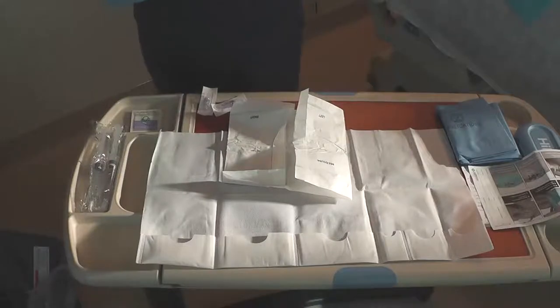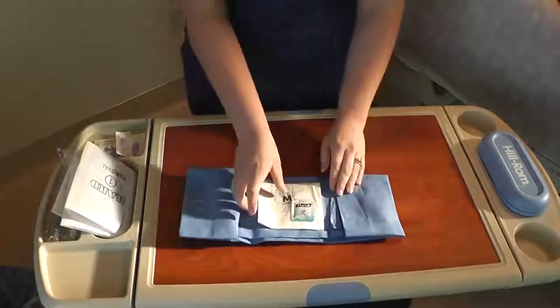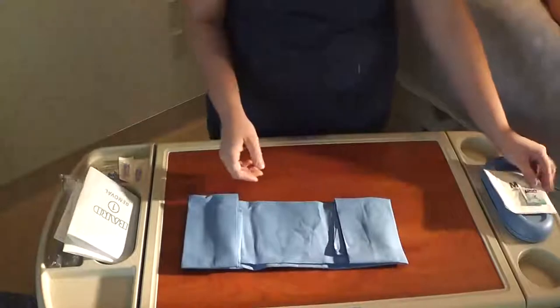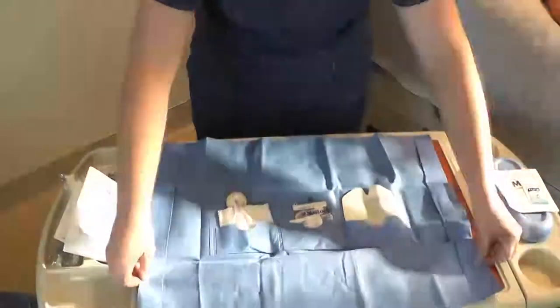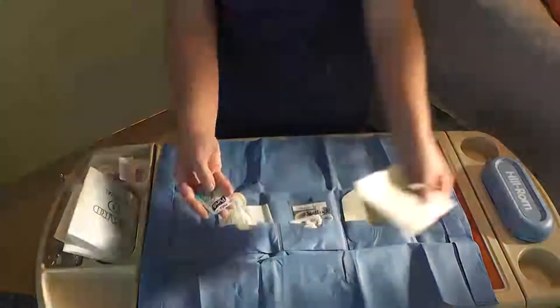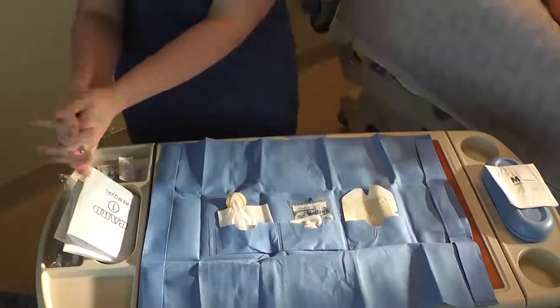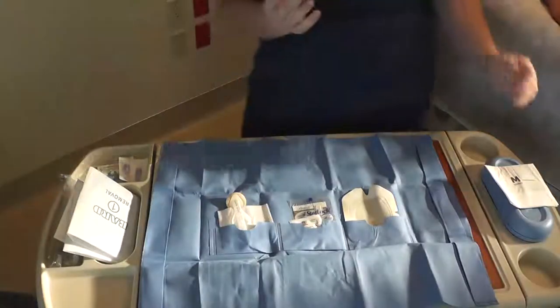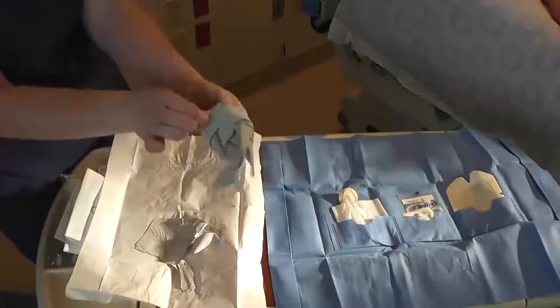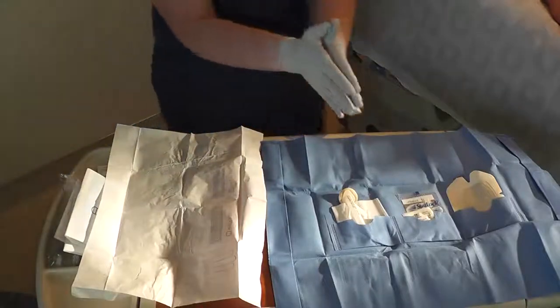Discard used products from Step 1, remove gloves, and then open Step 2 to reveal a second pair of gloves. Set the gloves to the side and completely open Step 2. Wash hands with the gel attached to these gloves, then don the gloves and start with supplies from left to right.